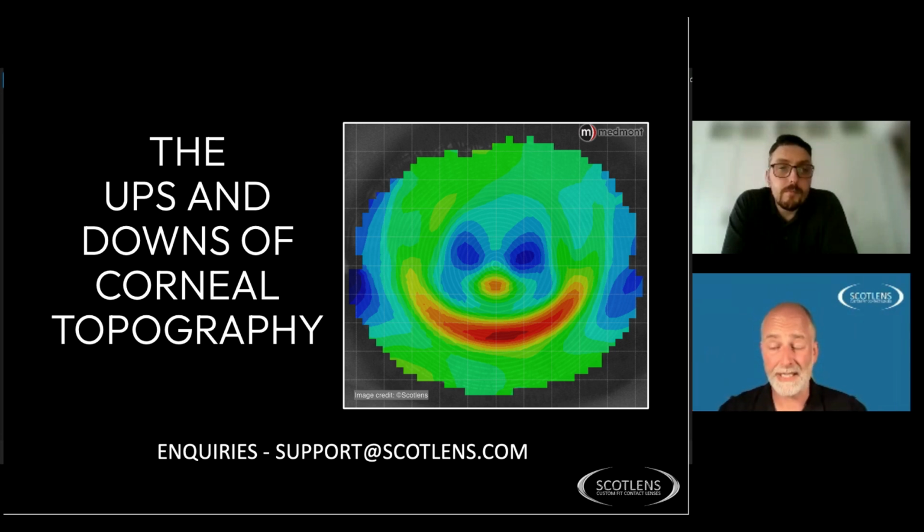It's got nothing to do with lens design. You can make a lens that could correct, in theory, 100 diopters of myopia, but it's the epithelial cell changes that limit it. The treatment zone gets smaller the higher the prescription, so you've got a really small distance-center multifocal prescription with an add equivalent to your fit. If you do a -10, you've got a 10 add. Imagine what the patient's quality of vision could be like.